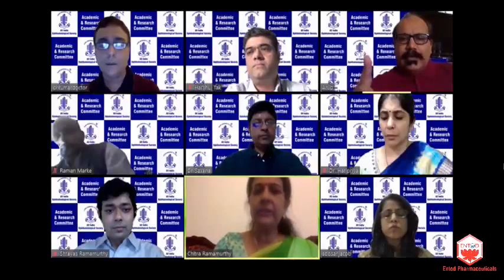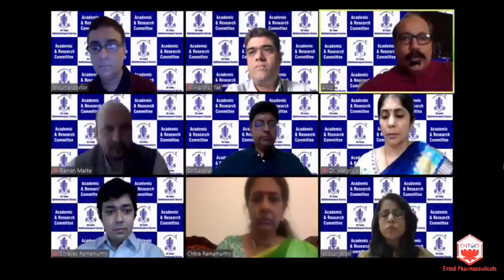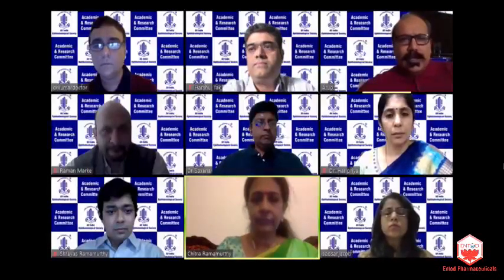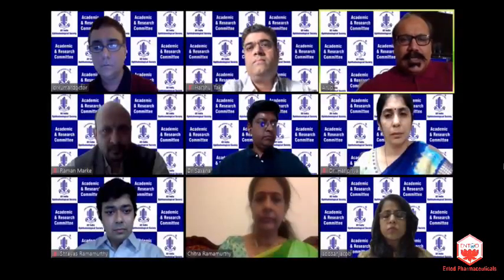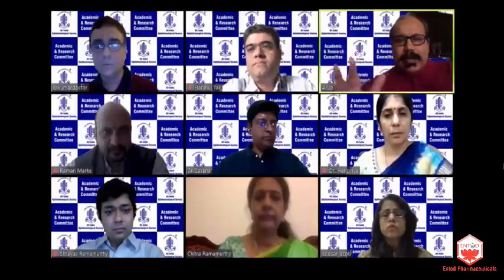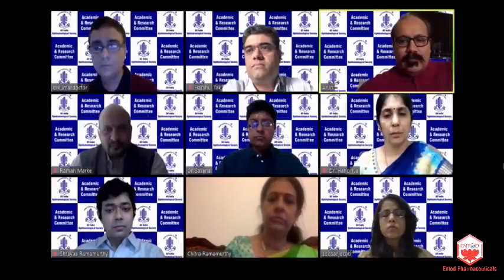Can I just add a comment here? There are two things. One question which Dr. Chitra had posed was, would you like to convert to a non-phaco technique? Now, there is one situation where I feel one should seriously think about converting to a manual SICS technique, and that is if you're dealing with associated comorbidities. When you have a very hard nucleus, a shallow anterior chamber, and the endothelial status is not good, that is the situation I'll seriously think about not going ahead with phaco and do a non-phaco technique.